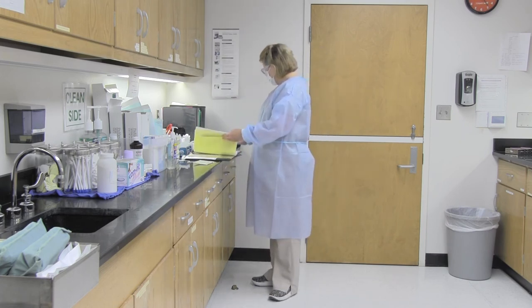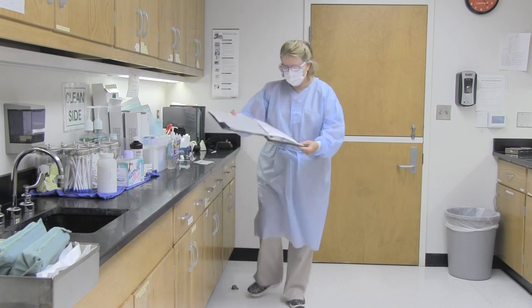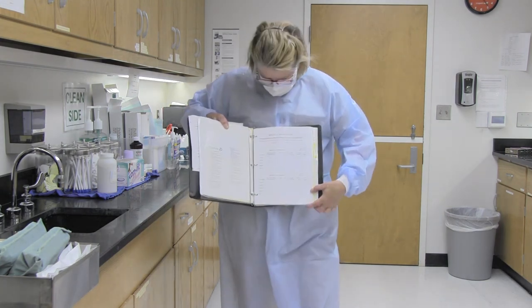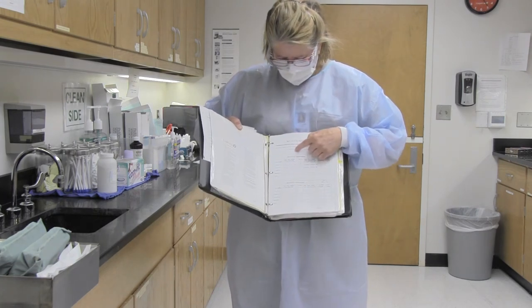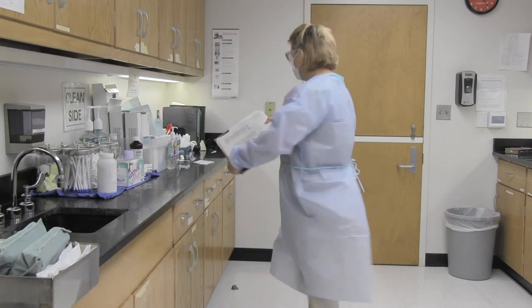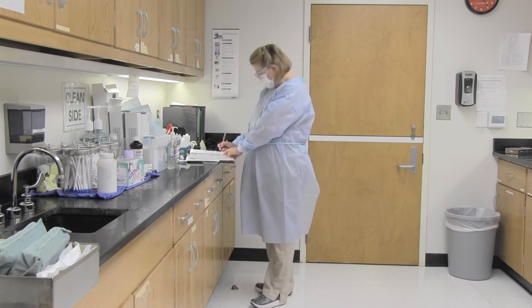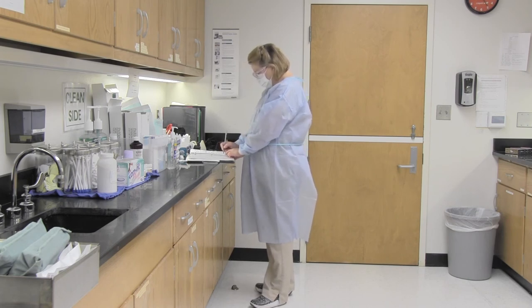As soon as the biomonitors go into the incubator, record the time they go in. We did a control and autoclave 1 for this competency. Write the date, the time, your initials, and the slot number. The control goes in slot number 1, and autoclave 1's biomonitor goes in slot number 2.